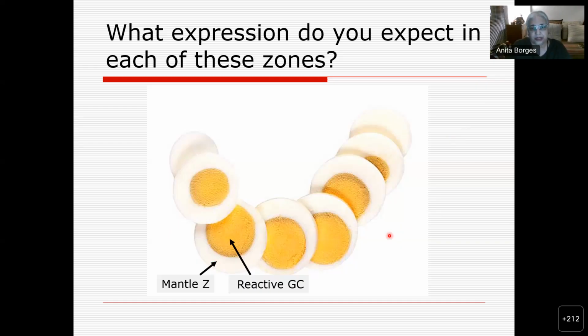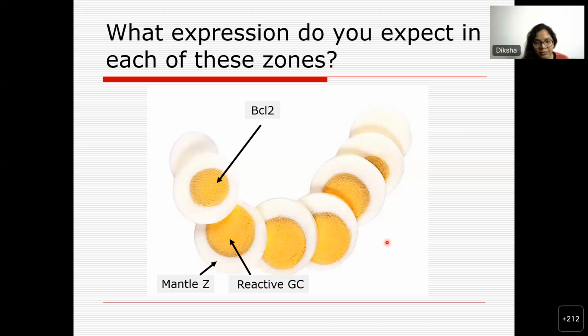All right. Now, what expression of BCL2 will you find in a reactive germinal center? That should be very easy. Now, come on. What's written in the chat box? Negative. Excellent. Now, what will you find in this zone over here? Positive. Absolutely.